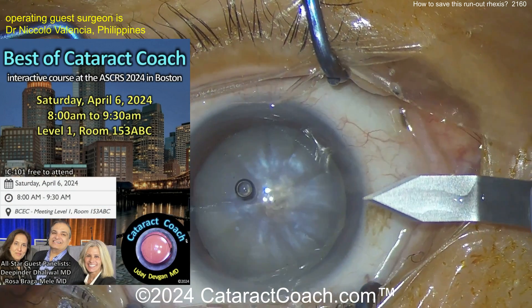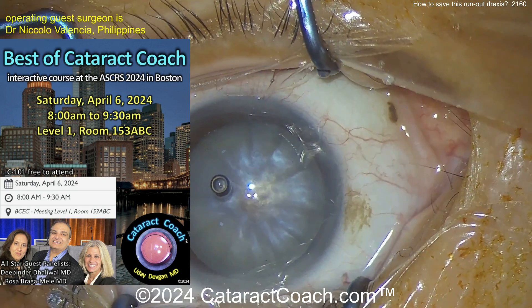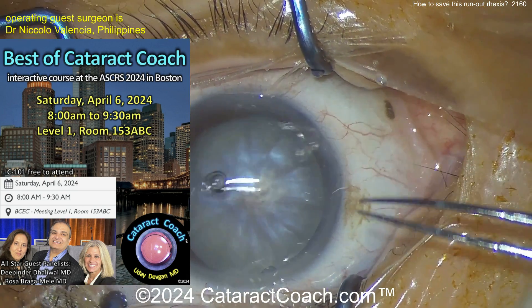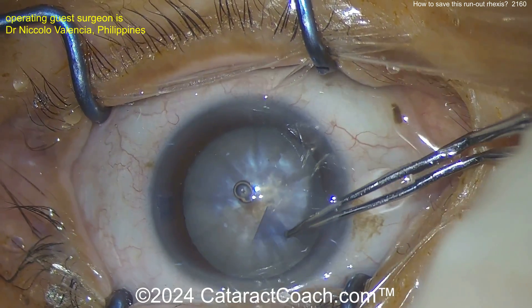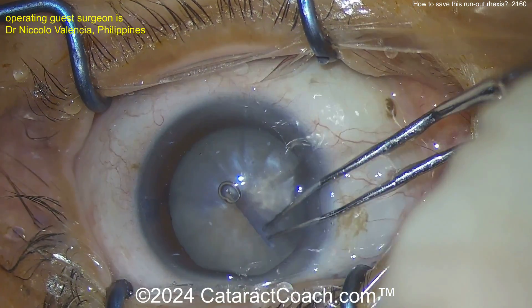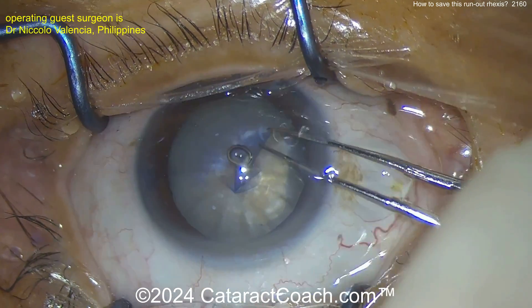A little more viscoelastic. This Saturday, April 6th, is our ASCRS Best Of course at the ASCRS meeting in Boston — 8 a.m. I will see you there. You'll learn a whole lot. Now get the rhexis and watch carefully.